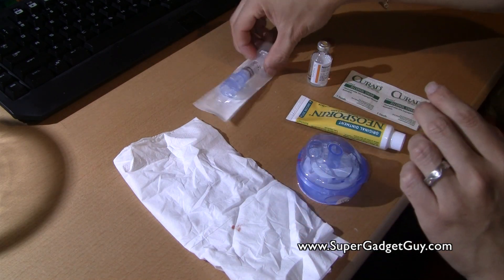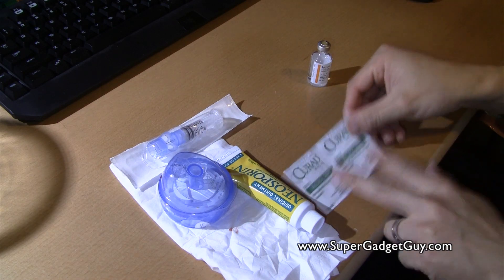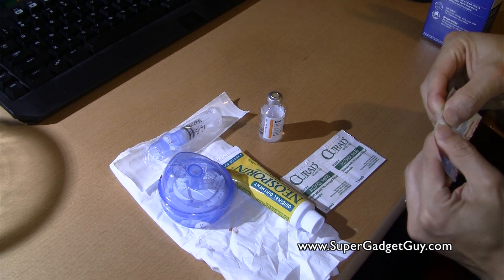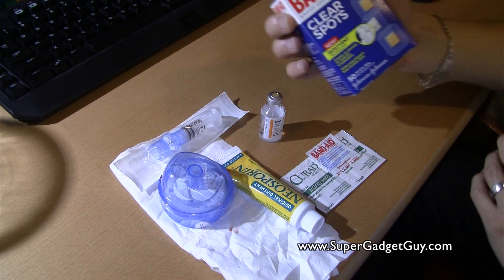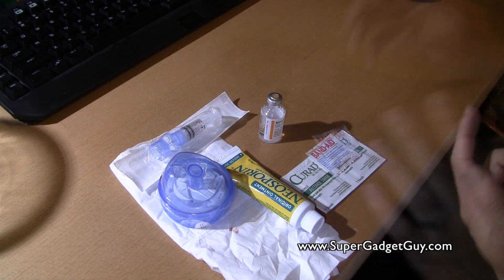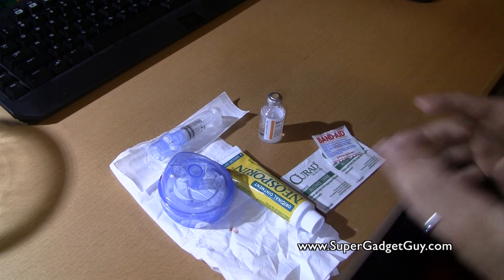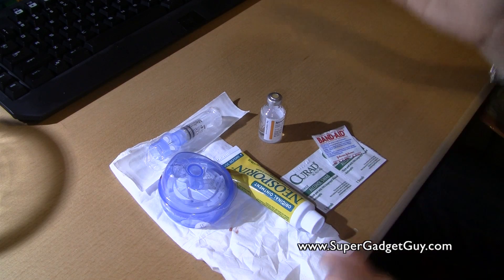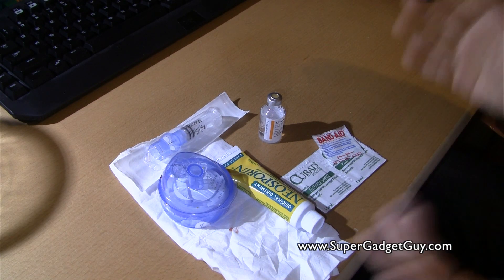What you basically need is the reservoir, the infusion set, Neosporin, two alcohol pads, an insulin bottle, and a band-aid. You can use one of the spot band-aids — I bought these off Amazon, they're clear spots. Please check with your nurse, endocrinologist, or pump trainer for the proper procedure of doing an infusion set change. This is how I do it — I do this once every three days, but check with your medical professional how often you should do your set change.